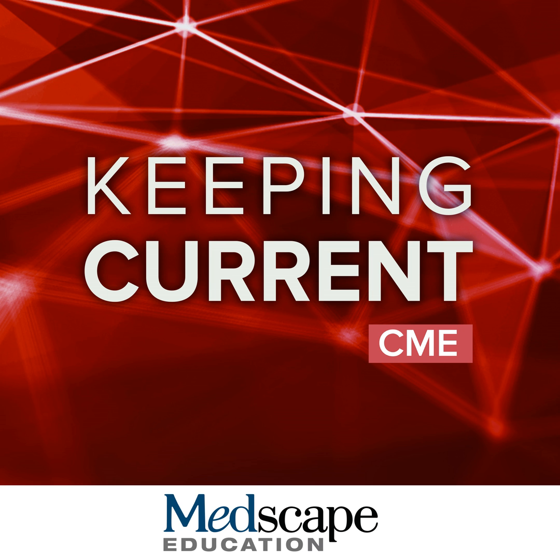The next question is, can I use a CT to evaluate for ARIA? And CT is not adequate to evaluate for ARIA. So we would expect that in a case of moderate to severe ARIA, so that would be larger regions of ARIA, you could see that edema on CT. However, smaller regions of ARIA-E would not be detectable.